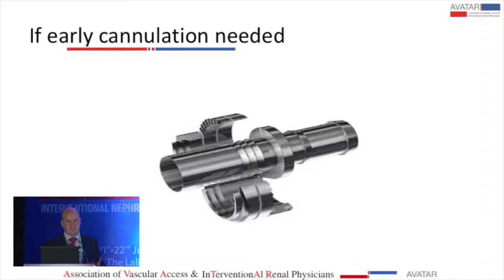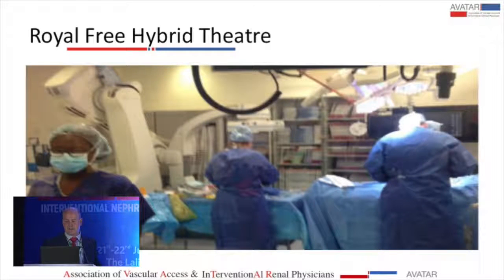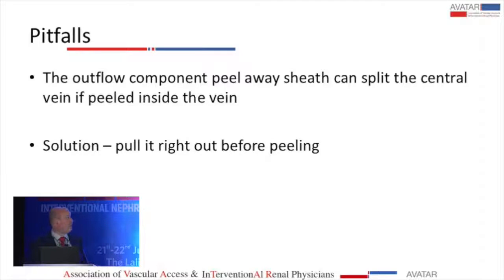I think these things work best when there's been an access in the arm already and the artery is already developed. You know, when you make an access, it's not just the vein that matures, the artery also grows with it. And you need that kind of flow to drive this kind of graft. So what you need to do is take the inflow as high as you can on the biggest bit of the brachial artery that's available to you and keep the graft as short as possible, just enough to cannulate. So this is courtesy of Dr. Homan again. He's taken the inflow, look, right up there where you put the top end of a brachioaxillary graft, proximal brachial artery, and he's tunneled it round the shoulder, and I'll explain why later.